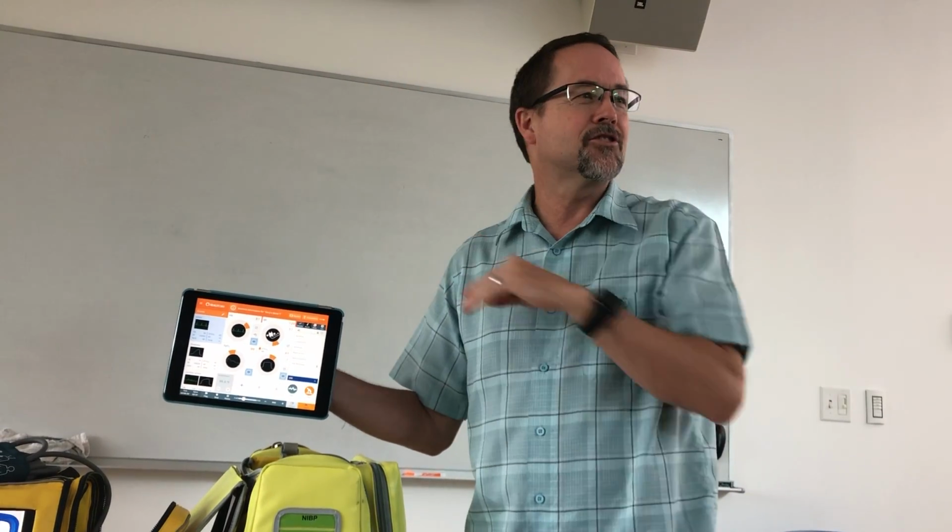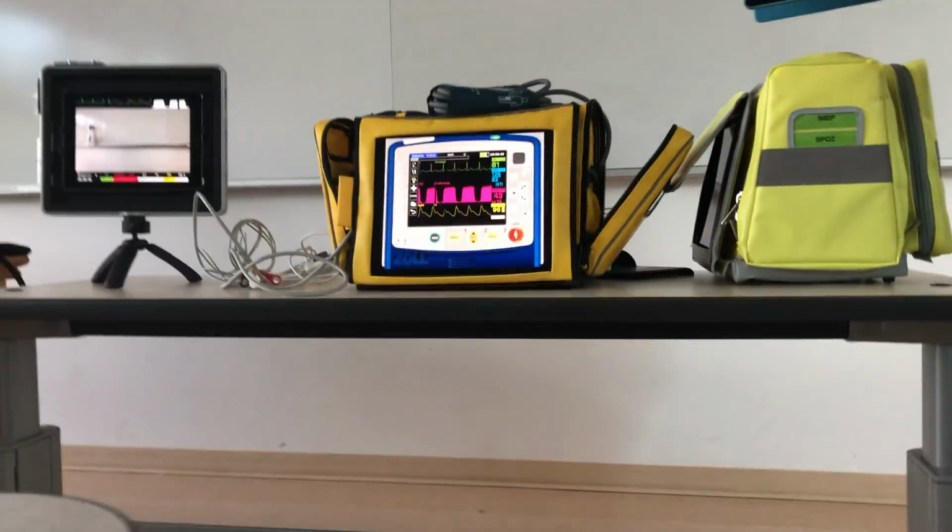You set these changes, and I want it to happen over 3 minutes. The minute they push the epi, you hit that button and it just does all the changes for you. Or the next box down can be failed to administer epi, and the heart rate can go up, the respirations can get worse, they can go into cardiac arrest over whatever period of time. So you can set it up to automatically trend wherever you want it to go, which is also kind of slick.